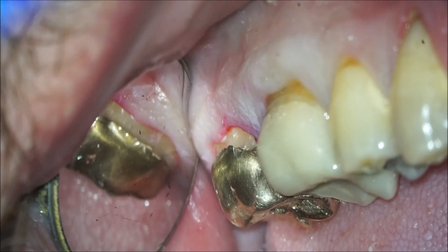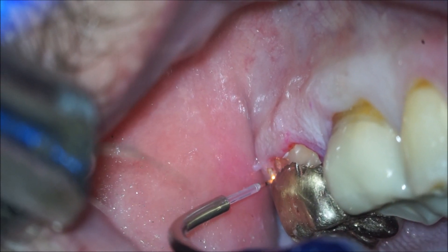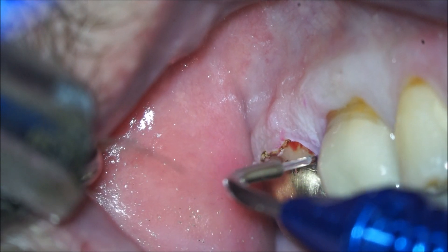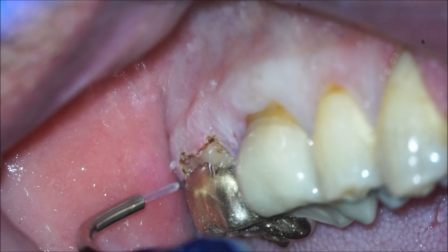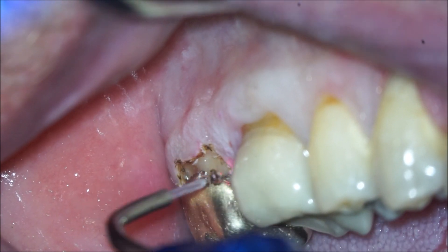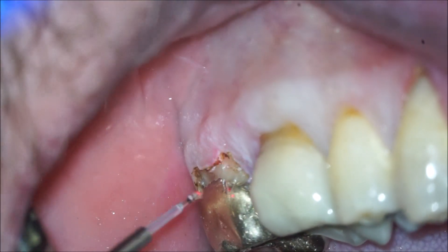You'll notice the gingiva is bleeding slightly there, and it's somewhat deep underneath the tissue as well. Before I go filling this tooth, I'd like to get that taken care of and get good access. So here I'm coming in with the diode laser — this is the Picasso Lite, and I'm using it at about 1.1 watts. I'm still seeing a little bit more charring than I would like. In general, I want it to just melt away tissue without a lot of charring. I'm experimenting with settings, trying to lower it down. I finally ended up at 0.8 watts, and that seemed to be a good setting to eliminate the charring.